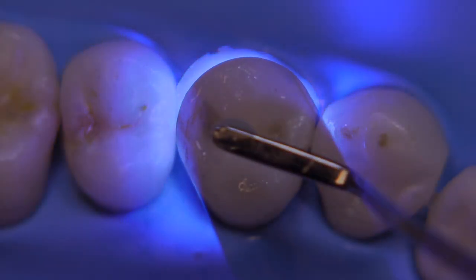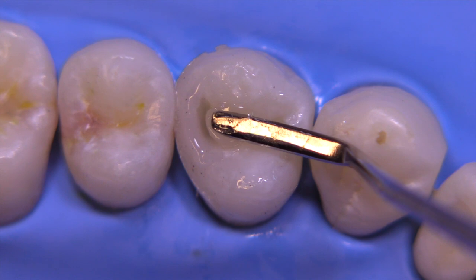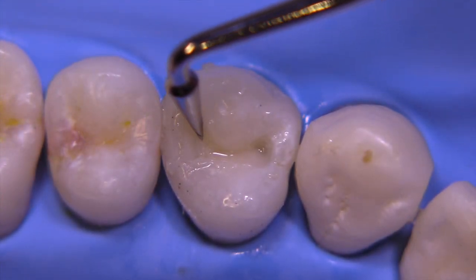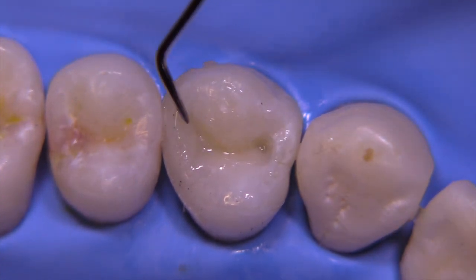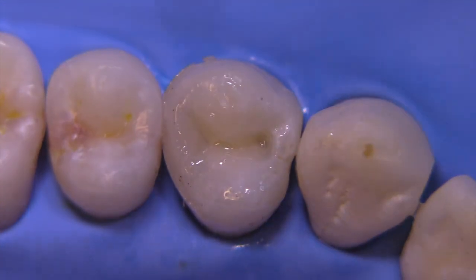We're going to continue to build the contour, once again under-contoured, with a dentin-type composite — not a super translucent, but more of an opaque dentin in the shade you want for the final restoration. This is another one of the Compo Sculpt tips.